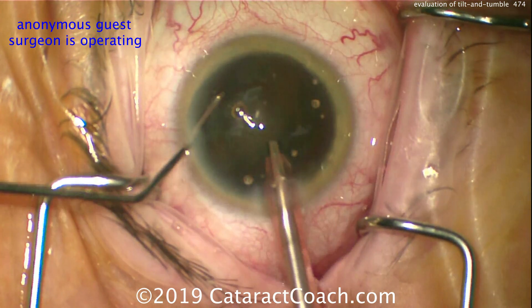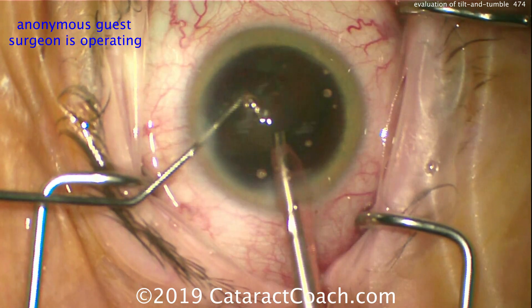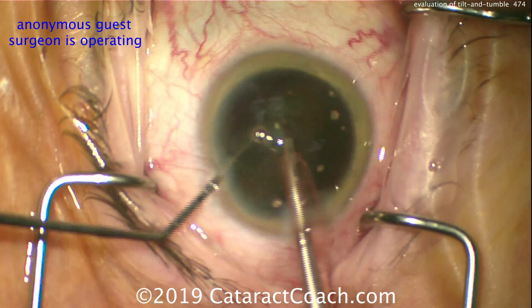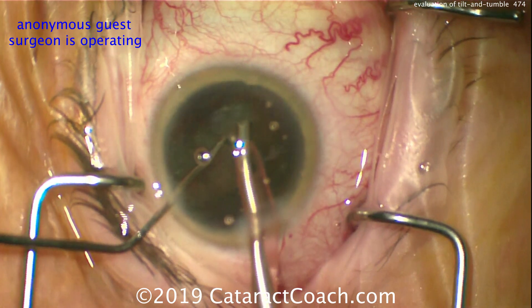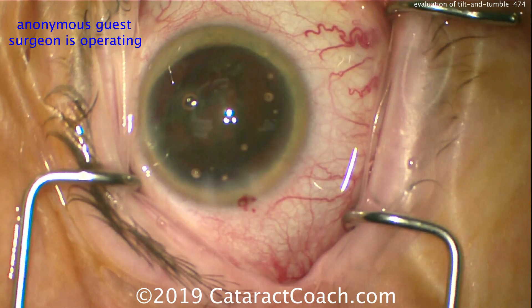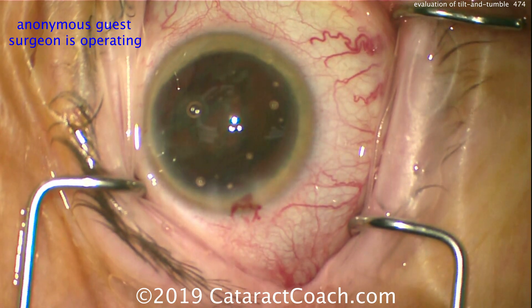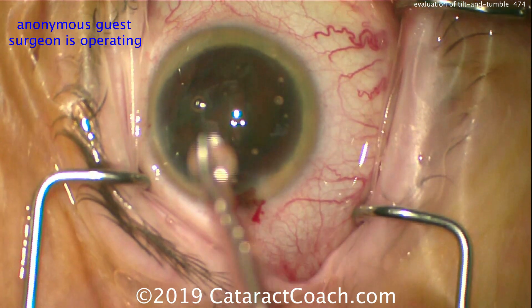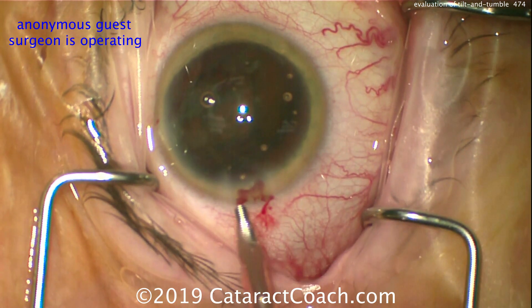About half the nucleus is gone — the second half comes out a lot easier because there's more working room, and you can keep feeding it in. So pretty good technique here, a couple of recommendations: adjust your FACO settings, show me a higher flow rate of at least 35 cc's a minute. Make sure your infusion bottle height is commensurate with that level. Keep the vacuum high at about 400 mmHg, make sure you're occluding the FACO tip with lens material to achieve the high vacuum. Use the chopper to keep the pieces in front of the FACO tip.